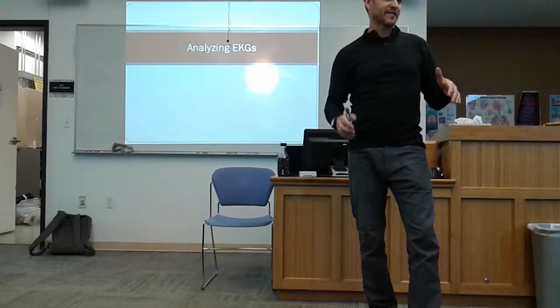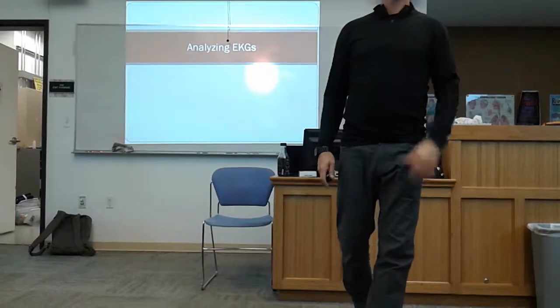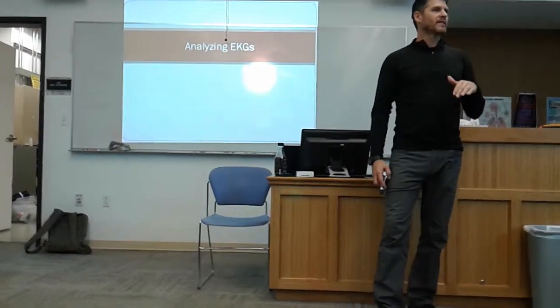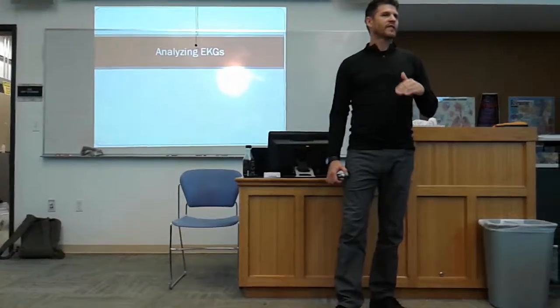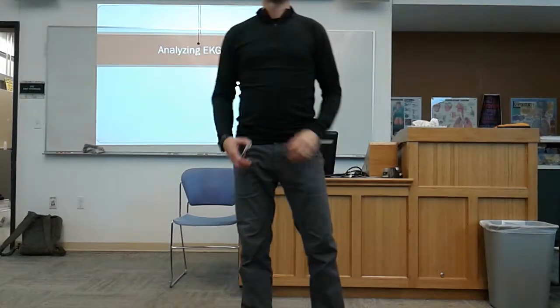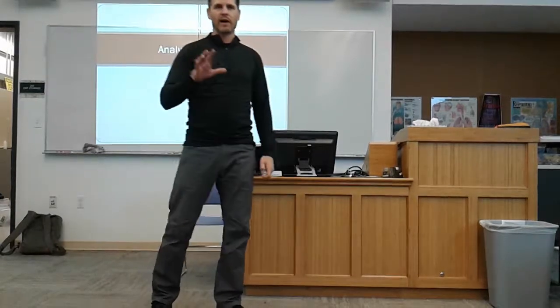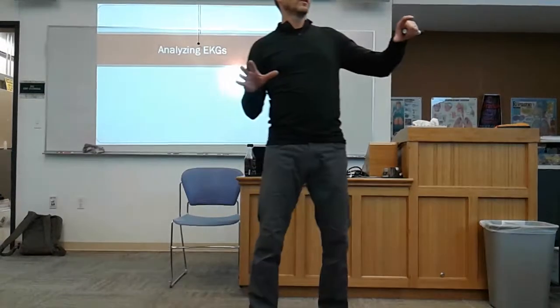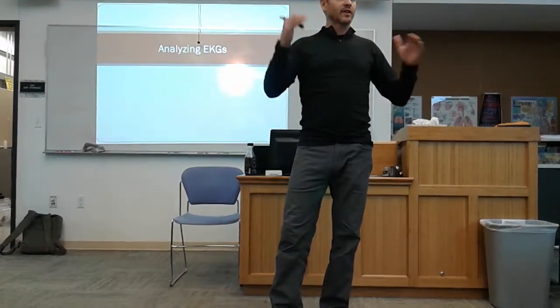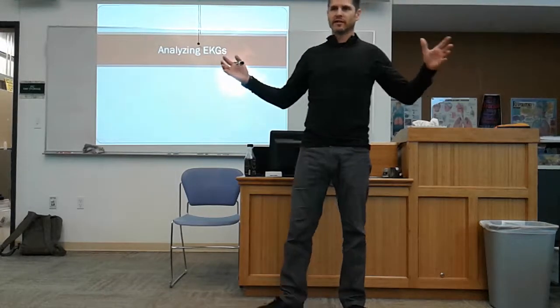You got to practice this, okay? You need to have a systematic approach to every single EKG you ever look at. And you need to make it second nature. But in order to make it second nature, you have to have some sort of a systematic view that you look at them every single time the exact same way. So I'm going to present one way for you to do that, and I'm going to encourage you to use that way. And as we get more and more sophisticated rhythm strips that we look at, I'll add to this and adjust it slightly as we go to make the system a much larger system.